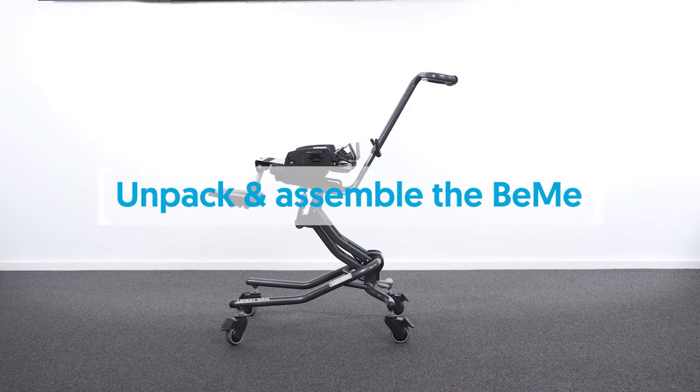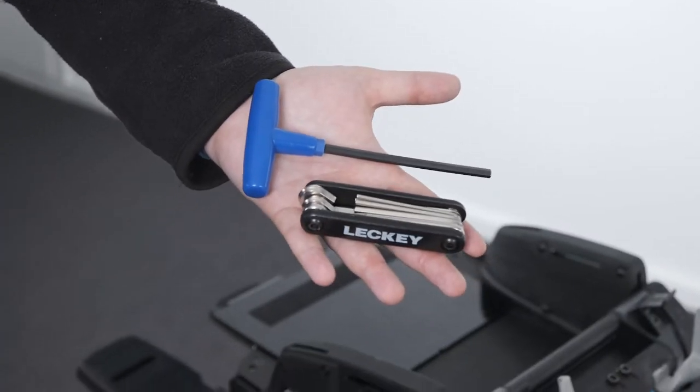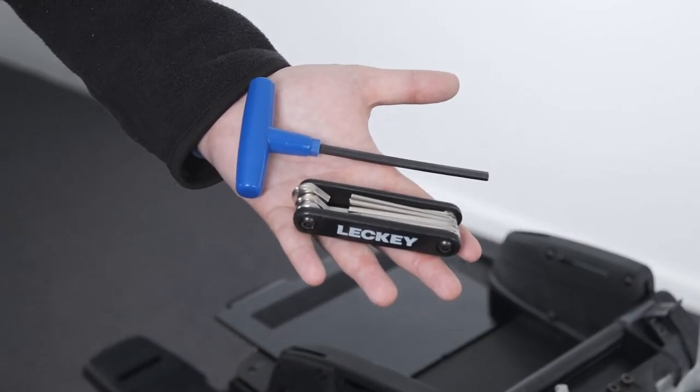How to unpack and assemble the Beamey seating system. All parts will be contained in polythene bags with each one clearly labeled. Carefully check you have all the correct parts. Several adjustments will require the use of the multi-tool or long handled Allen key which is supplied with each seat.